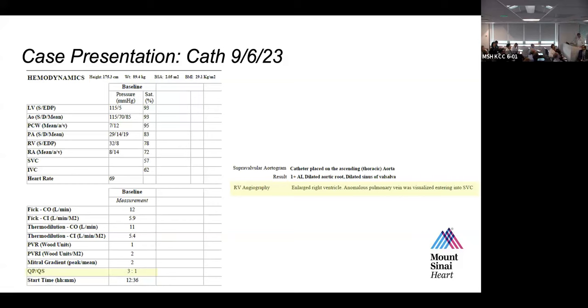I know we're running short of time. Just very important from a clinical standpoint, the shunt run is very important, but your PVR and your PA pressure are very important. So we're going to go down a management arm, but for the fellows in the room, understand the anatomy, but then understand the physiology, what that anatomy is doing. The PVR is normal here. Very interesting how we decide the PVR.